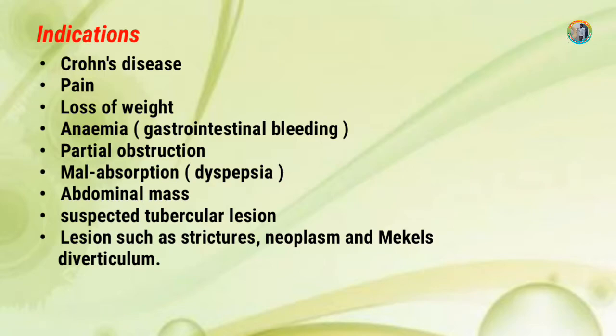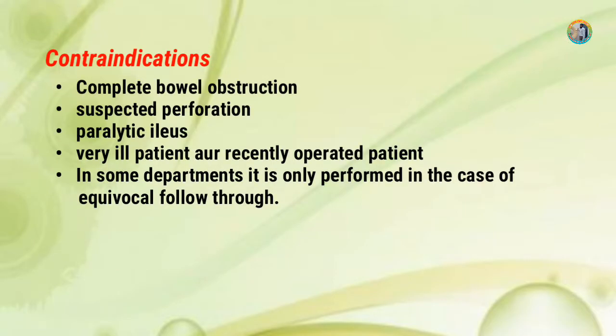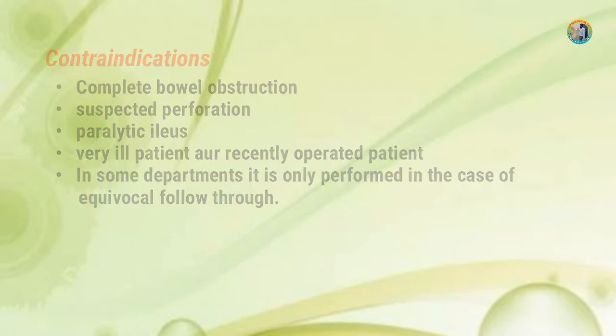and Meckel's diverticulum. In contraindication, the exam cannot be performed in the following conditions and symptoms: complete bowel obstruction, suspected perforation, paralytic ileus, very ill patient or recently operated patient. In some departments, it is only performed in the case of an equivocal follow-through.